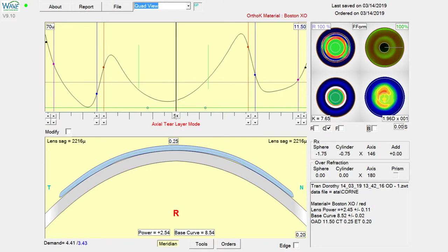Okay, a little bit over so we'll back off. Now we're about a half diopter flatter in the base curve.